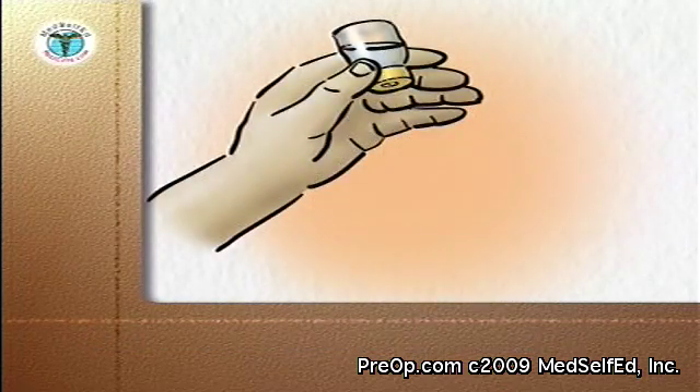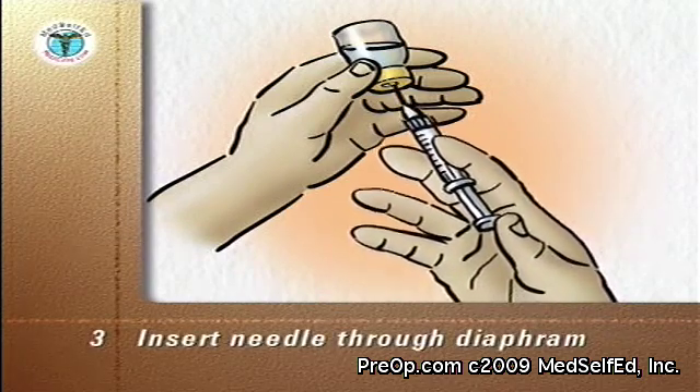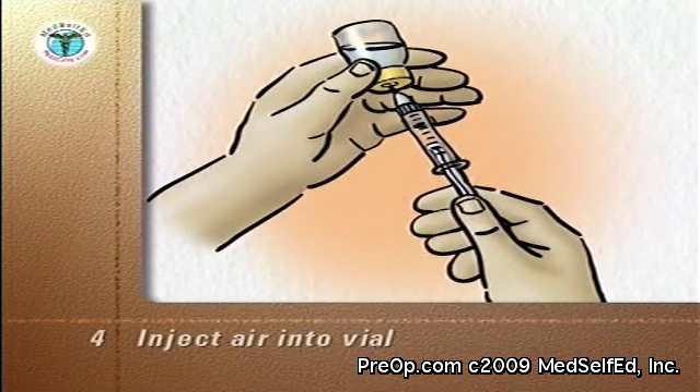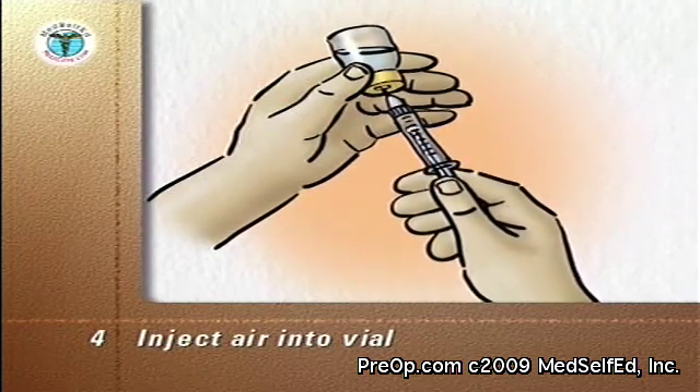Hold the vial upside down at eye level. Without touching the needle, insert it through the diaphragm of the vial. Keep the tip of the needle below the level of the medication in the vial. Depress the plunger to inject the air into the vial.